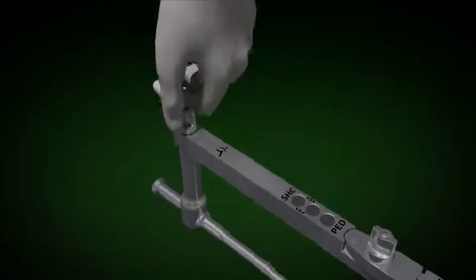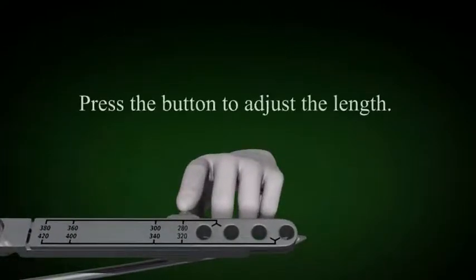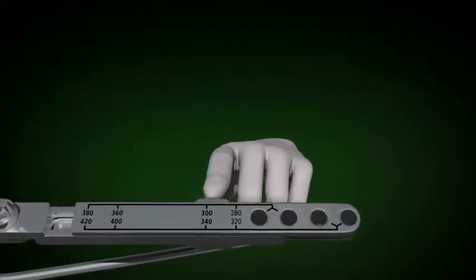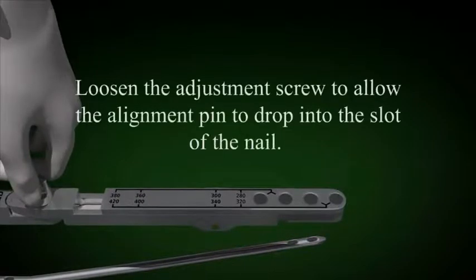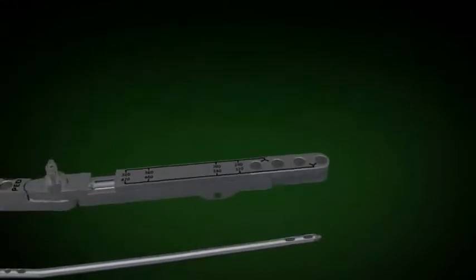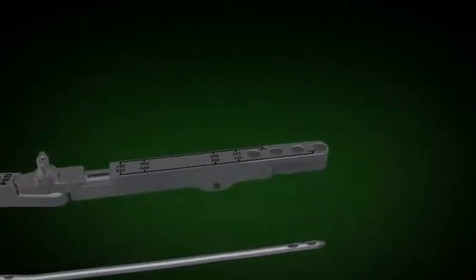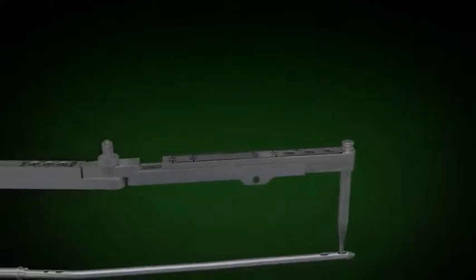Note the button that can be pressed to change the length of the distal extension to match the size nail you intend to use. A set screw, which does not show in this video, is used to stabilize the distal extension. The distal extension is then placed over the slot in the nail and the adjustment screw is tightened.